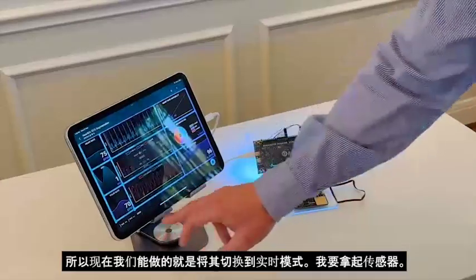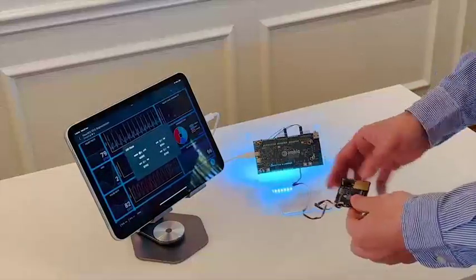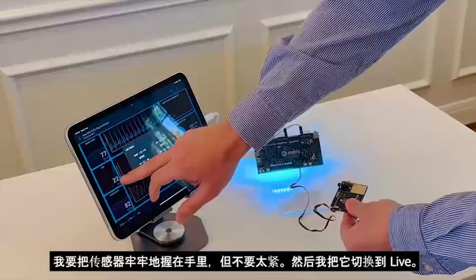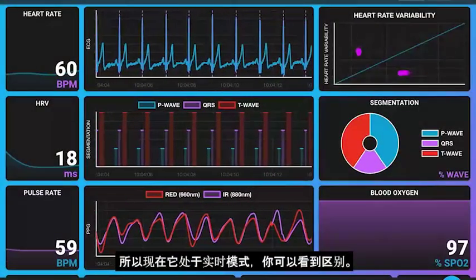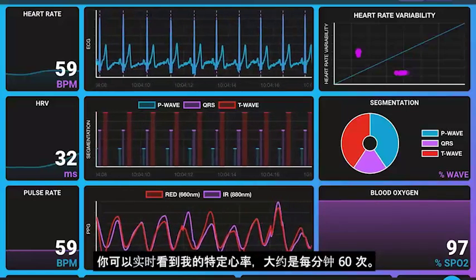So now what we can do is switch this into live mode. I'm going to pick up the sensor. I'm going to hold the sensor in my hand firmly but not too tight, and then I'm going to switch this to live. So now that it's in live mode, you can see the difference. You can actually see in real time my particular heart rate, which is around 60 beats per minute.